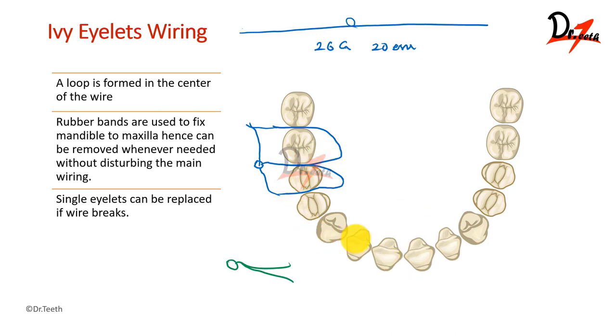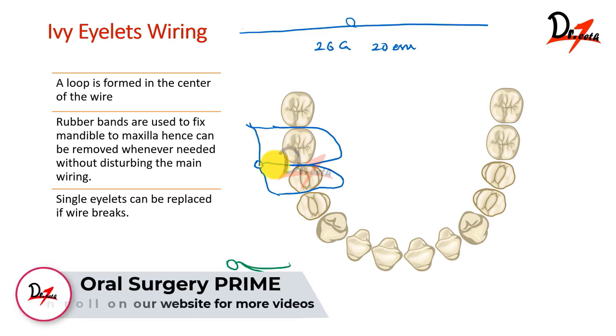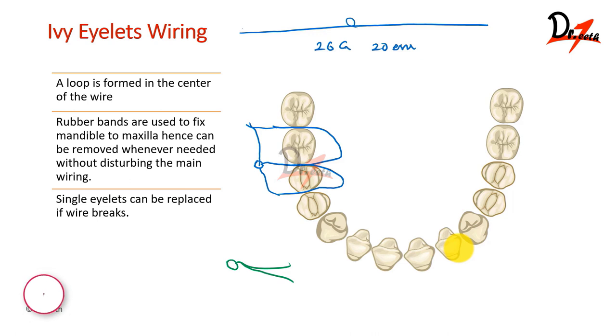This is done because we don't want to create any kind of cross bite. If we tighten the wire on one side first, a cross bite might be produced, and if you are tightening the anterior wires, it can produce a posterior cross bite. Make sure you start from the molar area of one side, then the other side, and then reach towards the incisor area. Also, when we tie these wires, they should be loose first — because first we have to establish a proper occlusion and then tighten it. In case we have an edentulous area where some teeth are missing, we can use a modification known as the clove hitch method.